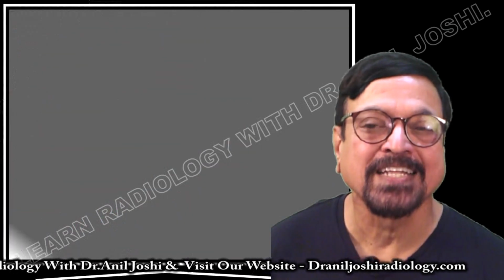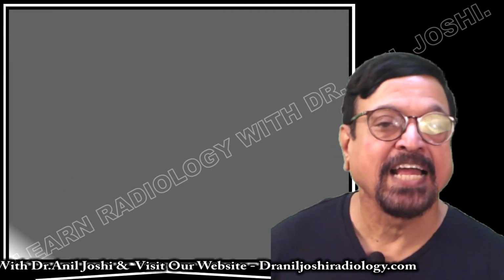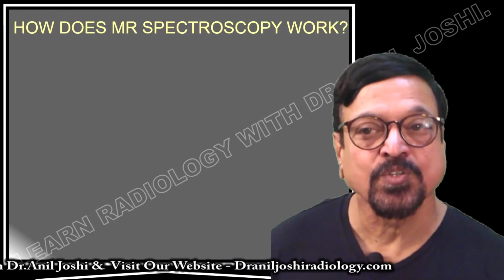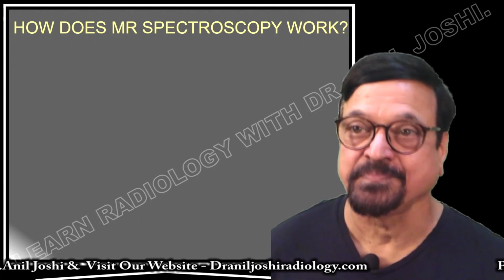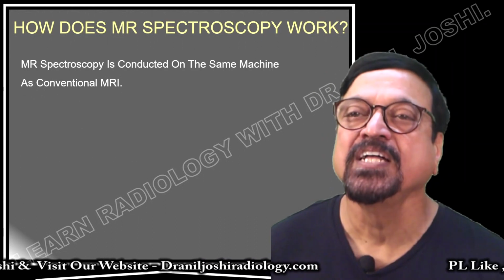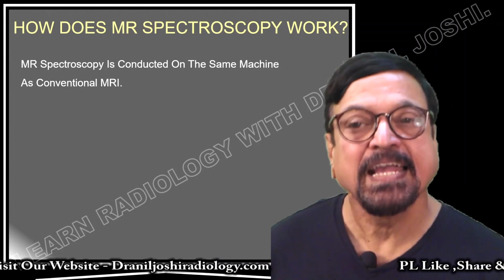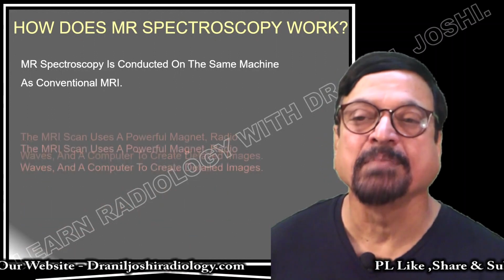So, not only in malignancy, what we will see is in encephalopathies also it is used, in benign lesion like meningioma also they are used. So, lot of applications and specific. How does MR spectroscopy work? MR spectroscopy is conducted on the same machine as conventional MRI.